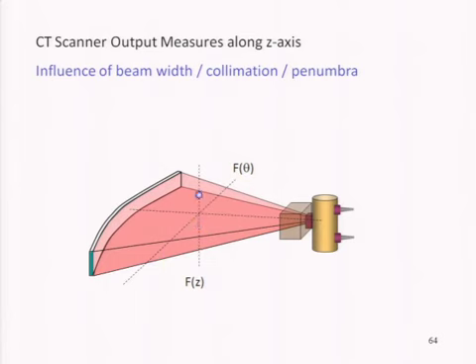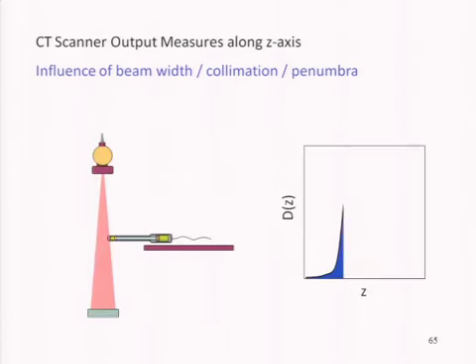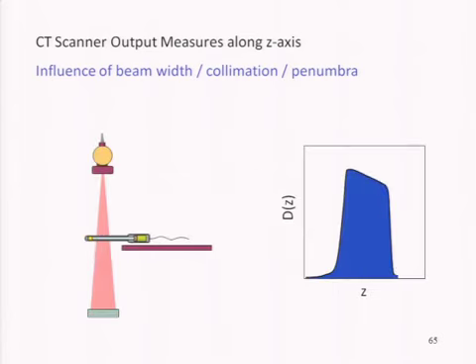So what about this axis? Well, we have this real-time probe in our arsenal, if you believe what I said earlier this morning, and so why not put it on the end of the table and just have it translate through the beam as the scanner is rotating, and you essentially measure the in-air dose distribution at isocenter, and that's one characterization of the output of the scanner at a given technique factor, kV and mA.